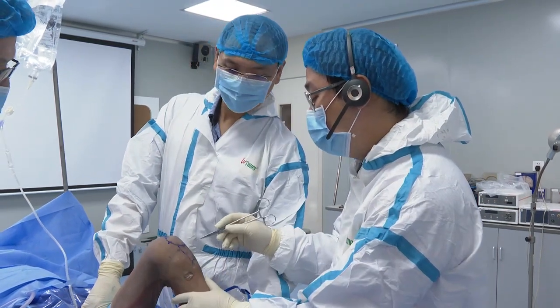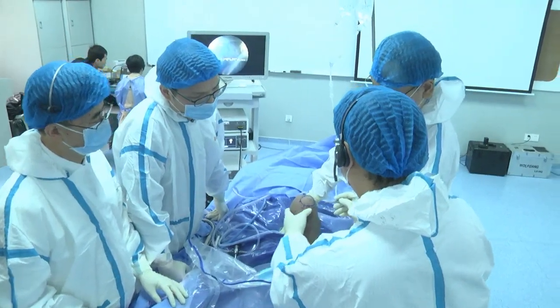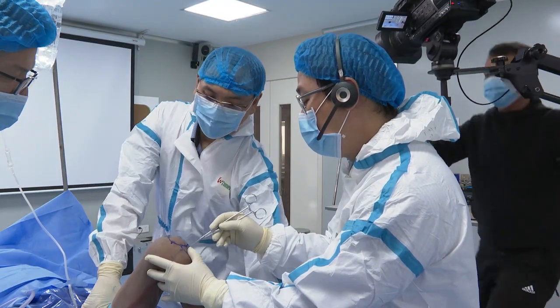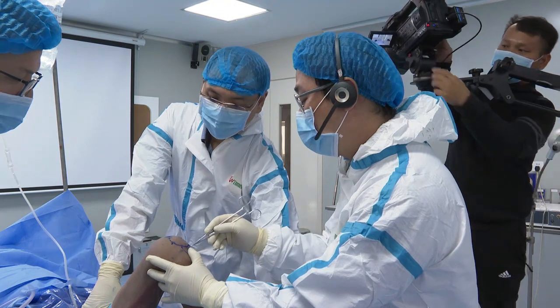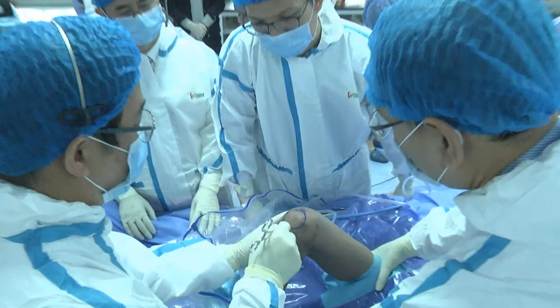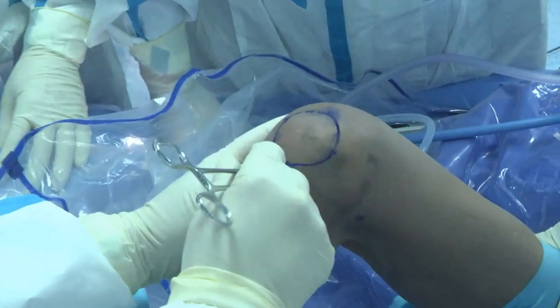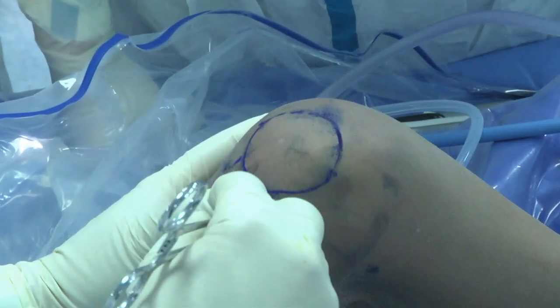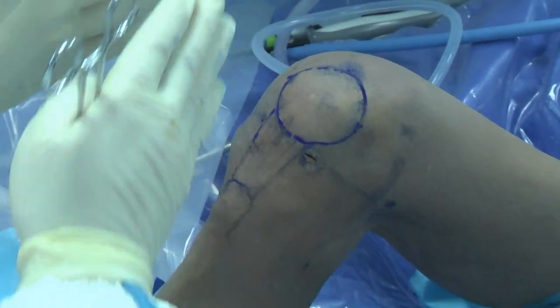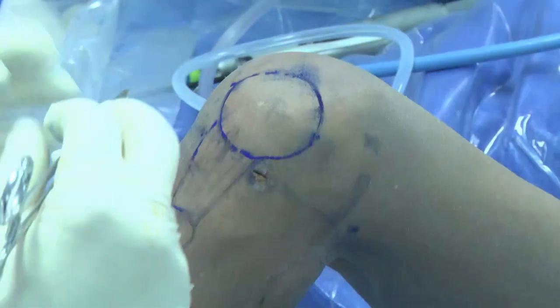Okay, so we start. I prefer to use the transverse incision. This is our 11 blade. So we do this way, transverse, okay? I use the number 11 blade this way, transverse. You go left and also you go right. Okay, so it will not be like going straight. It will not be small at the end, okay? You go left and right.